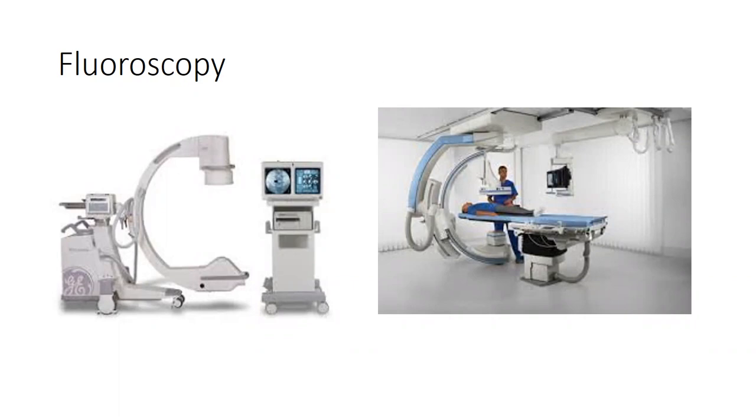Right, torso, thyroid, breast, gonads. Okay, and actually cornea too. Increased exposure to this can increase cataract formation. So many people who do a lot of fluoro every day probably should actually have special leaded glasses for this too.